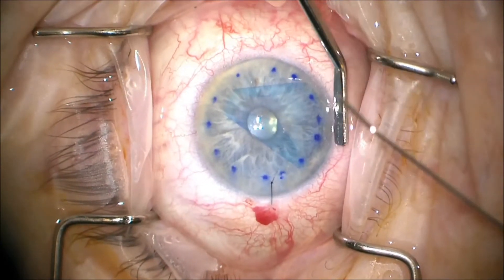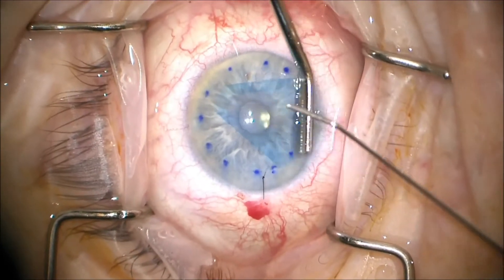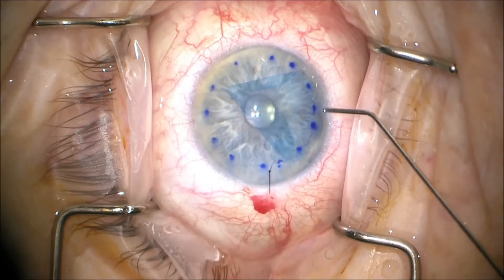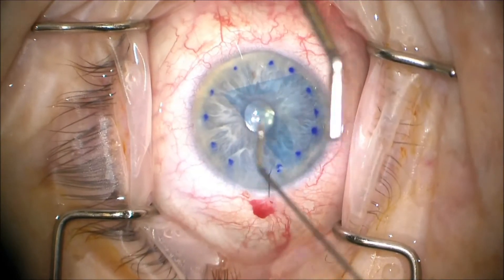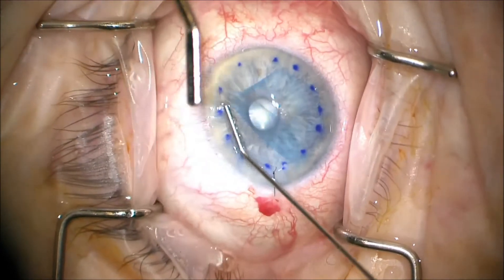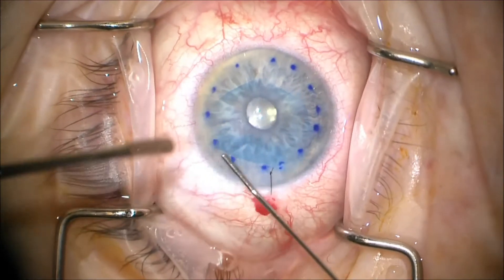We place a suture in the main wound, and then we deepen the chamber a little bit, but not too deep, and then we start unfolding our graft. So here we're basically unfolding, and we think that we have it in the correct conformation as it's going.